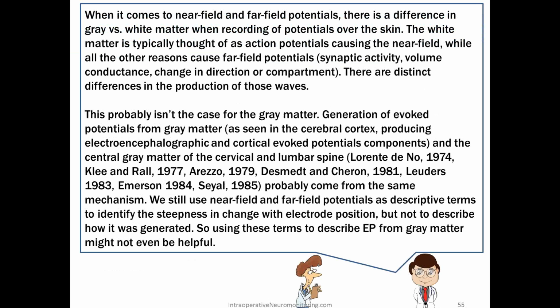All right, when it comes to near field and far field potentials, there is a difference in gray versus white matter when recording the potential over the skin. The white matter is typically thought of as action potentials causing the near field, while all other reasons cause far field potentials, like synaptic activity, volume conductance, change in directions, or changing compartments. There are distinct differences in the production of those waves, but this probably isn't the case for gray matter.